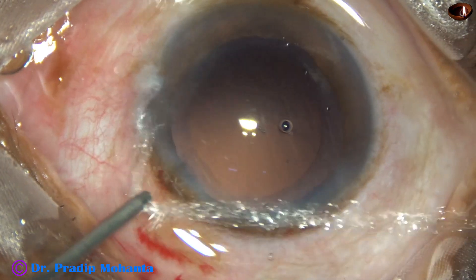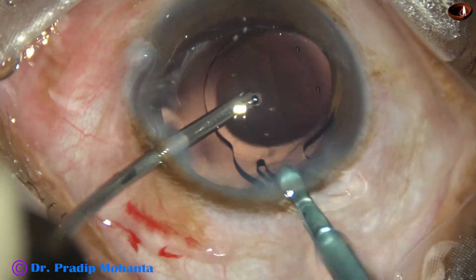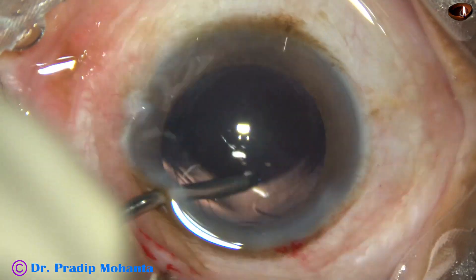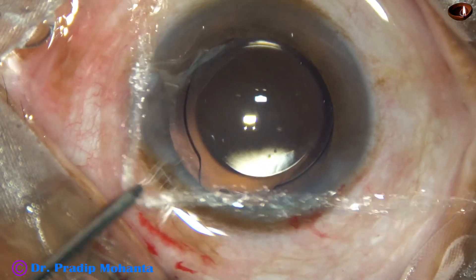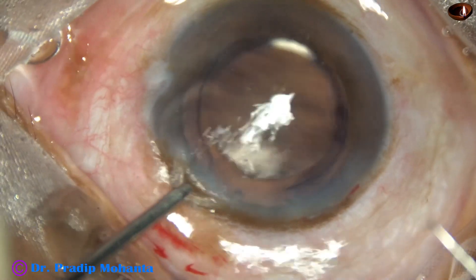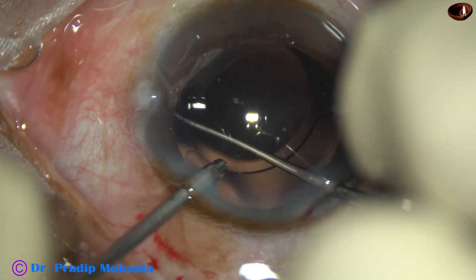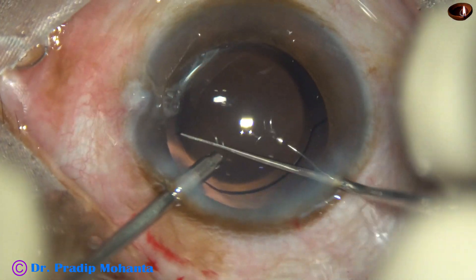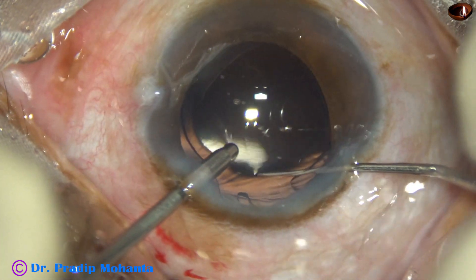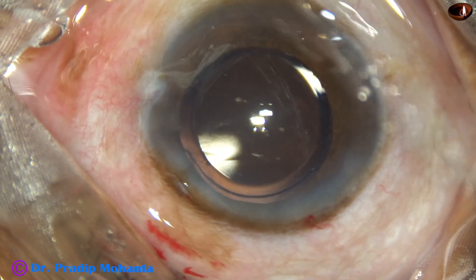We can remove most of the cortex by Simcoe, but the whole cortex can also be removed by Hybrid IA. It is better to use a combination of Simcoe and Hybrid IA. By the time you use Simcoe, your assistant is ready with the Hybrid IA, and she or he needs some time to cap the aspirating port and get ready with hybrid irrigation aspiration.